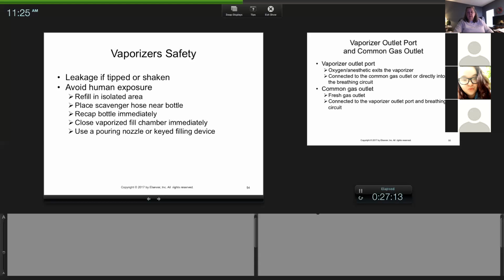There's a lot of clinics that probably won't have SEVO. You guys will use it in surgery, but when you go to practice, there's a lot of clinics that just use isoflurane. And some clinics will have both. But sevoflurane will get cheaper. It's a newer agent, so it is a little more expensive right now than isoflurane. But it will come down. So you don't want to waste any of these drugs because there is a fair expense if you leave them open.